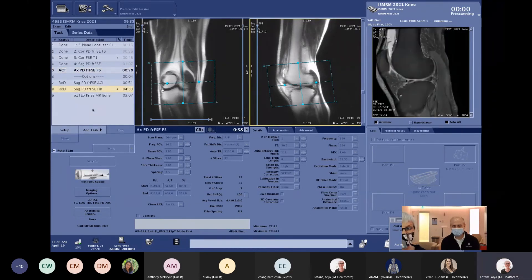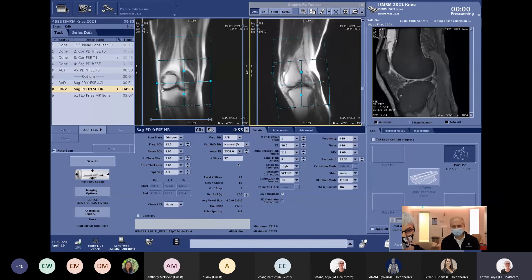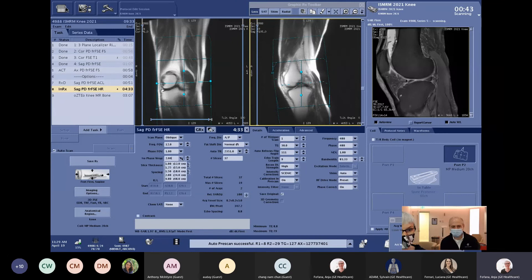We also want to show the other extreme of using Air Recon DL. Here we have an example where we do a PD scan and want really high resolution — a voxel size of 0.2 by 0.2. We still run only one average because we use Air Recon DL to make nice images. We can also use less no-phase wrap, maybe down to 1.5, to save a bit of time.